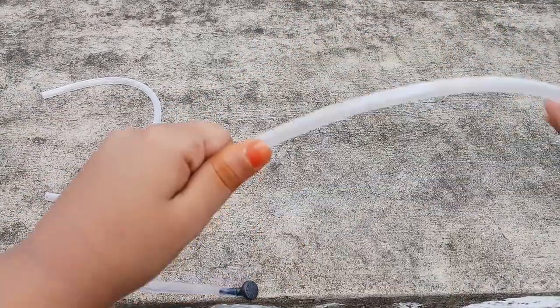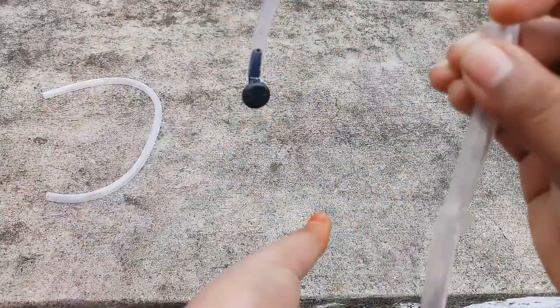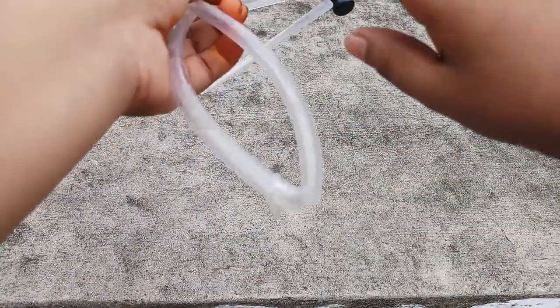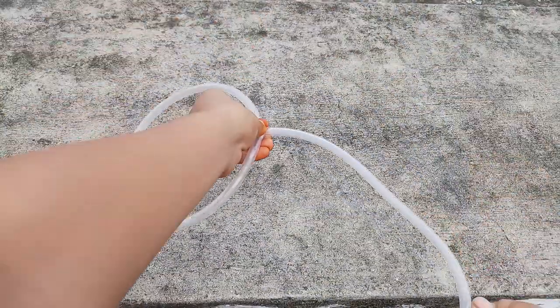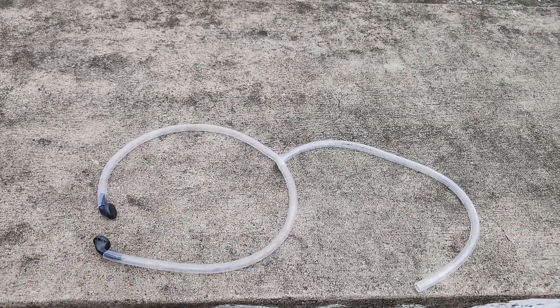Now, the thing that you have to do is keep a hole at the middle. You have to insert the smaller pipe into that middle hole to complete your stethoscope. Then apply some glue and your stethoscope is ready.